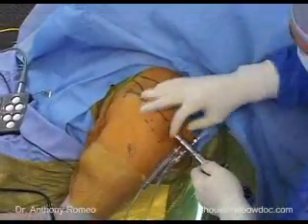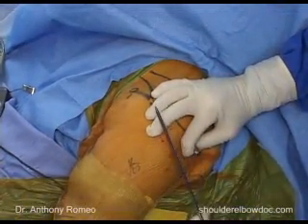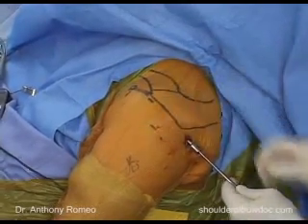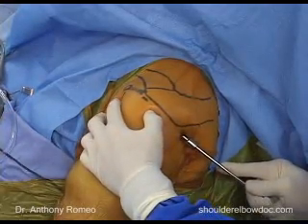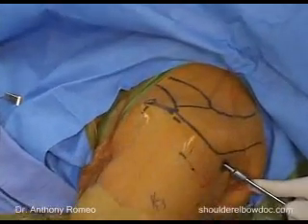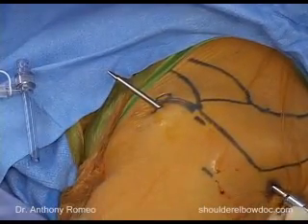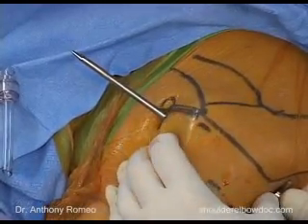We'll turn our flow off from our pump. I'll hold the cannula in place, and then we'll use a metal rod with a blunt tip — this is called a Wissinger rod. We'll pass that through our cannula into the anterior capsule, with a slight lateral push as we go through the capsule to keep it lateral to the coracoid process. It will pop through, and we came out pretty much where our mark was, lateral to the coracoid. We'll make our incision, insert the metal rod through, then take the cannula and push it all the way across the glenohumeral joint to help dilate the anterior capsule.